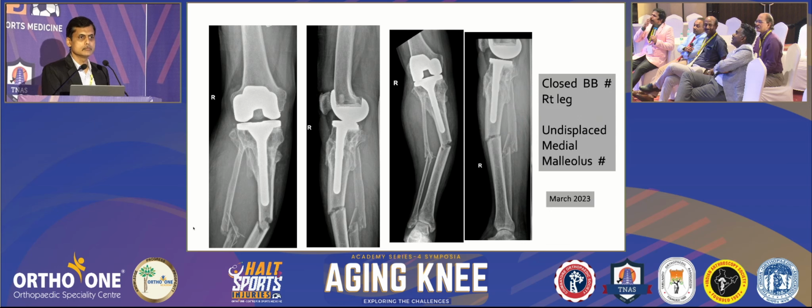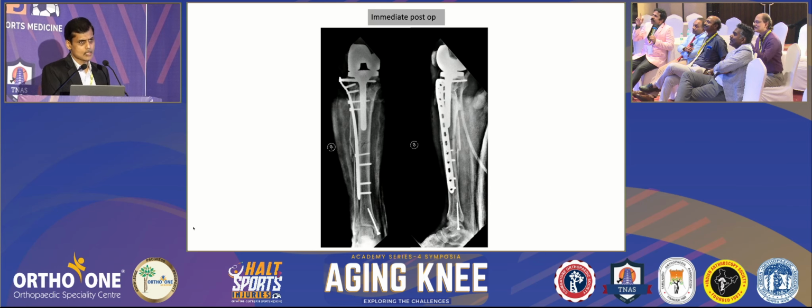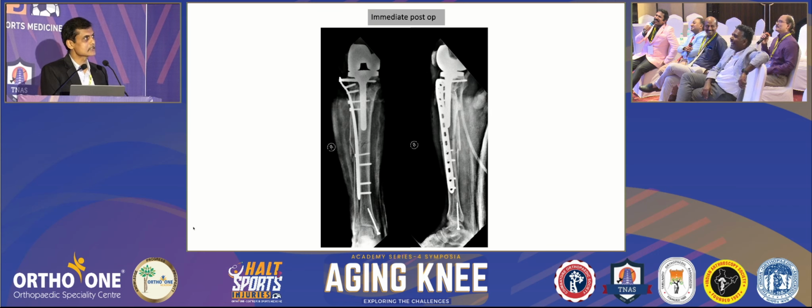A long MIPO plate, medial or lateral, always go for the side you need support from. Anyhow, this tibia fracture was not that comminuted, so we didn't want to add a lot of plates, because an implant is already there inside and the patient's soft tissue was also compromised. Adding so much metal would be a problem, so it was a very stable construct.